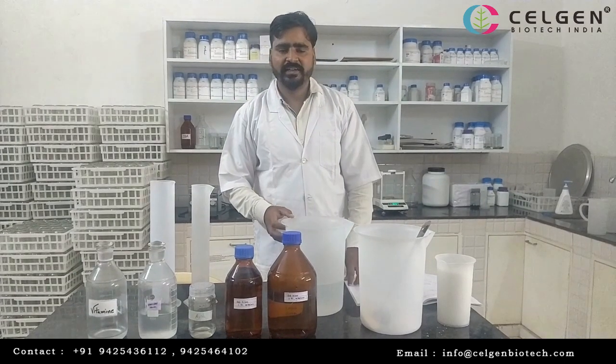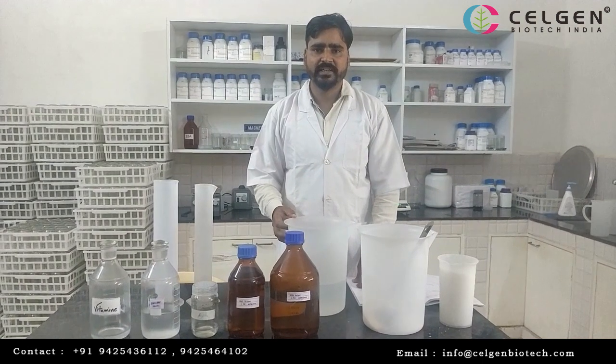I am from Celgen Biotech India, Gram Sivara, Vidisha. You can tell me about media preparation.